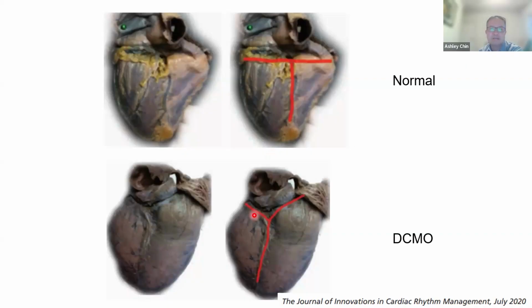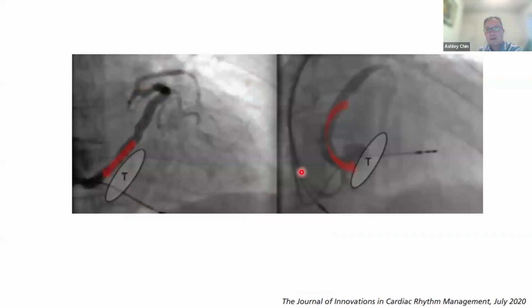Now, as the heart gets bigger, for example with a dilated cardiomyopathy, that T becomes a Y. And that's the difficulty sometimes, is that the coronary sinus then takes a posteriorly directed course. That's what people sometimes forget. What you have to do sometimes, and I find this quite commonly in big hearts, is that when you're withdrawing back and maintaining that counterclockwise torque, you actually have to face the catheter quite posteriorly because of the wide configuration that develops. It's no longer a T, it becomes a Y.